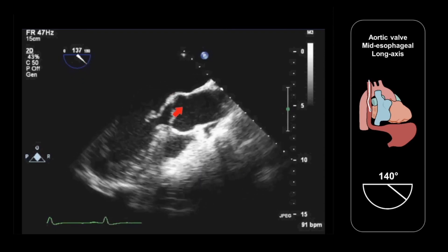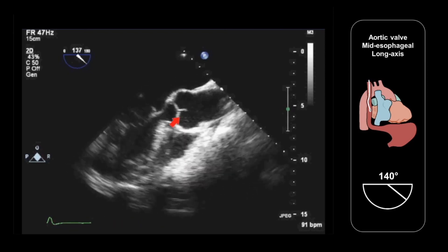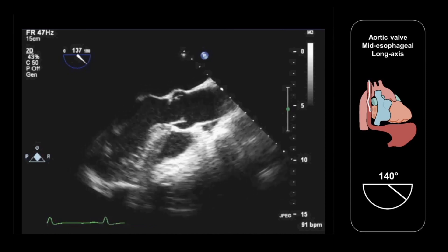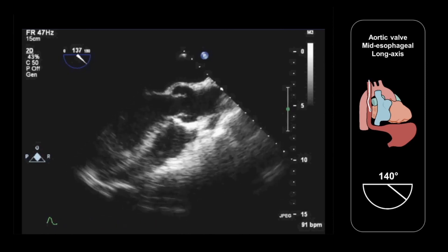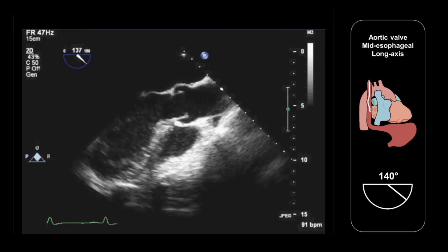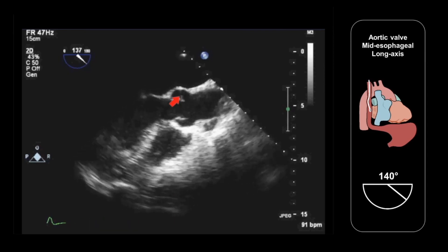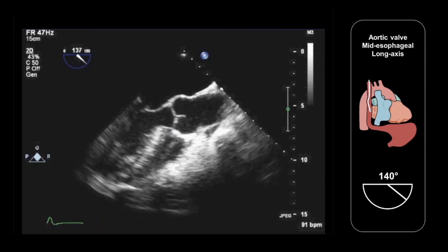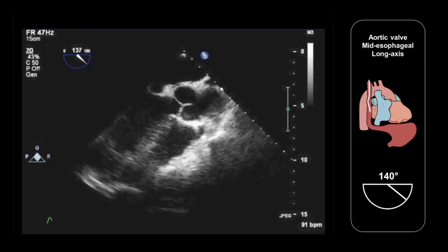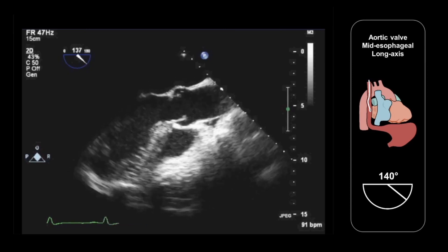Looking at the aortic valve itself, we can see two cusps here. The cusp in the far field is the right coronary cusp. The cusp in the near field is either the non-coronary cusp or the left coronary cusp, depending upon whether the probe is turned to the patient's right or the patient's left. By adjusting the probe position and turning it left or right, we can sweep back and forth across the valve. In this particular case, what we're seeing is the non-coronary cusp together with the right coronary cusp.